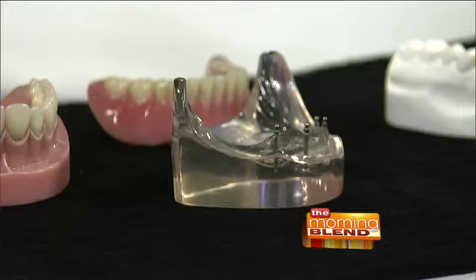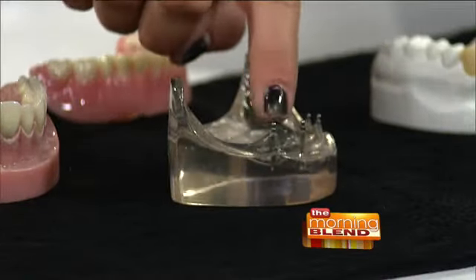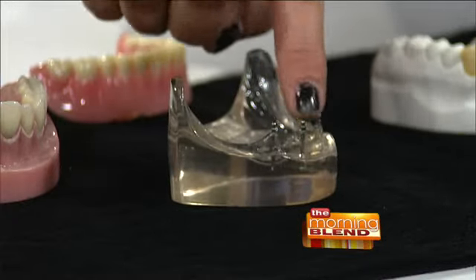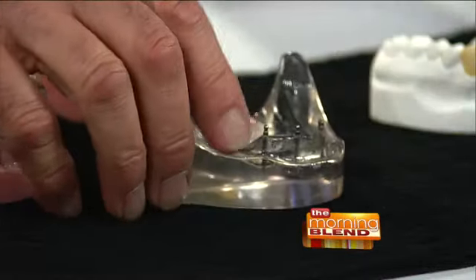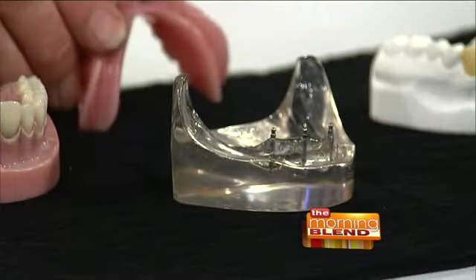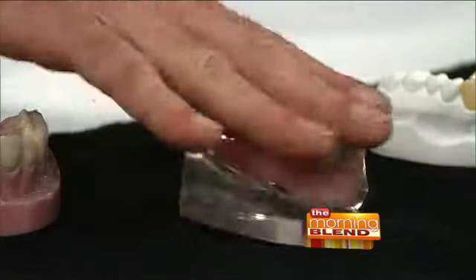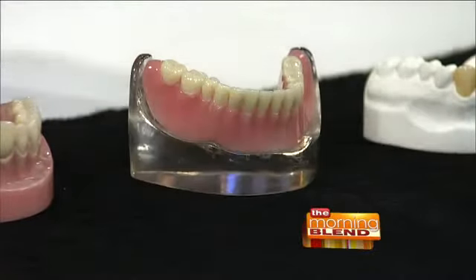your mouth. For example, if a patient has a denture, and no teeth at all, and the denture doesn't remain firm in their mouth, we can put the small diameter implants in, then retrofit the denture. Just to point out, it's these small pieces right here, the mini dental implants, that go into the jawbone, and then we retrofit the denture with these rubber O-ring housings, and then the denture will snap on, and it will be firm in the mouth and stay in place.